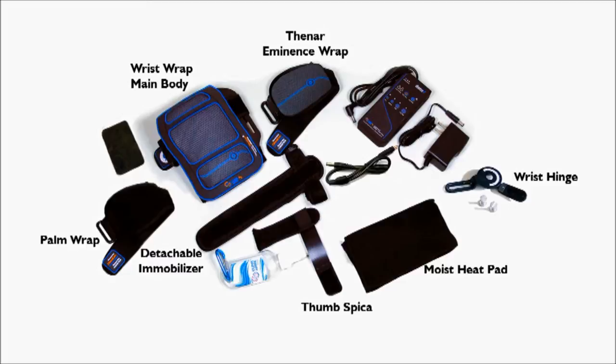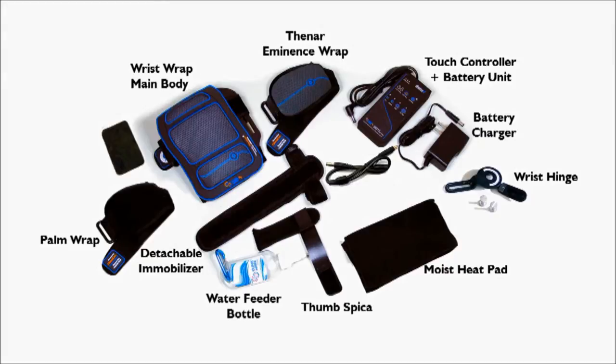Additional components include a moist heat pad, a rechargeable lithium polymer battery powered touch controller, a battery charger, a specially designed water feeder bottle, a Y extension cord, and a silicon pad.